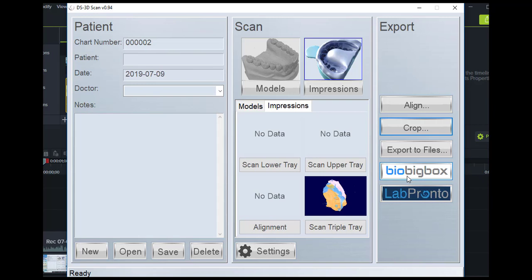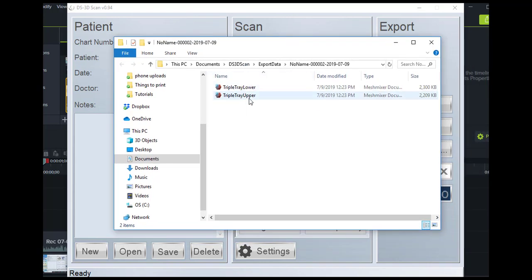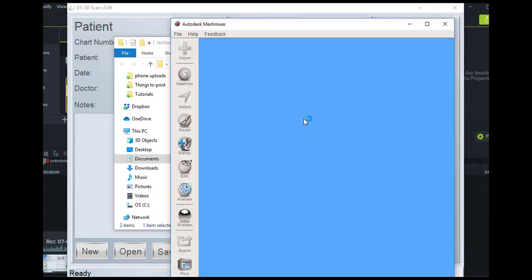Now you can export that straight to BioBigBox if you want to do cloud storage. If you want to send it straight to Lab Pronto to maybe have a crown made, you could click on the Lab Pronto plugin, or we could simply hit Export to Files. When we hit Export to Files, you're going to see that it now brings up the folder where these files are stored, and I'll just open them in MeshMixer very briefly to show you what these look like.